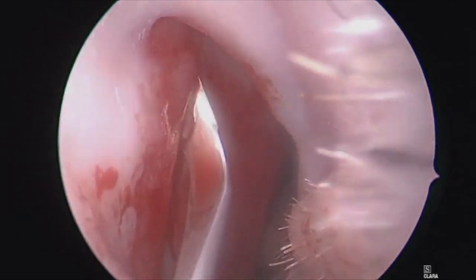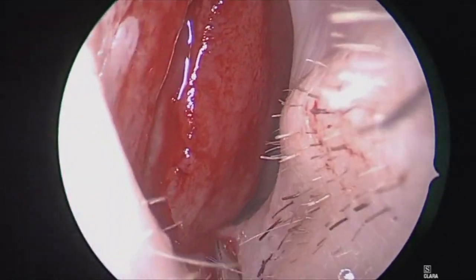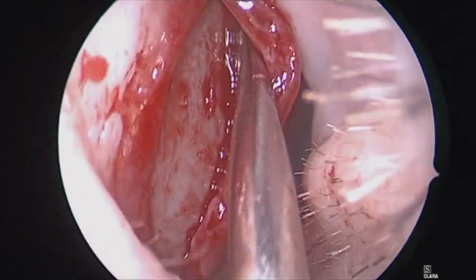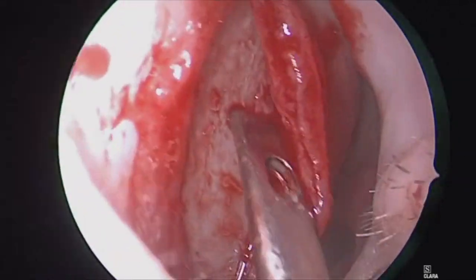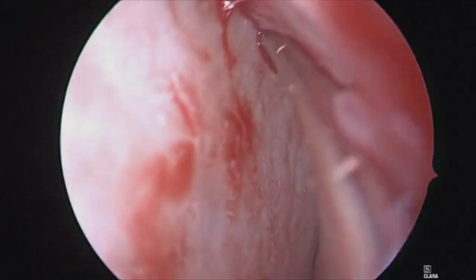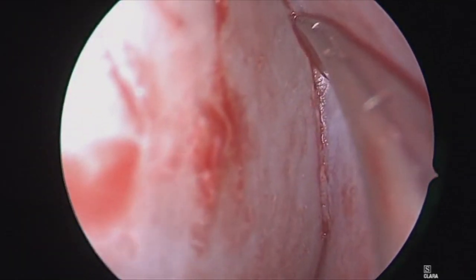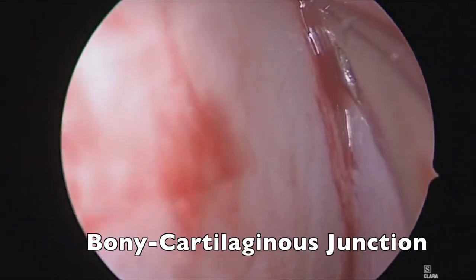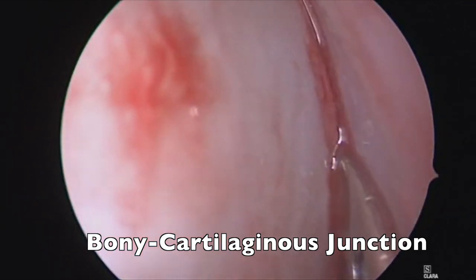We're just completing that incision a little bit higher there with our knife again, and it's nice to raise this in a very broad front, including very dorsally and towards the floor of the nose, to have nice wide exposure to decide where you want to take your cartilaginous cuts. Here we are raising this a bit more posteriorly, still in the cartilage just in front of the bony cartilaginous junction, and then getting onto the bone of the bony septum just past that junction and raising that more inferiorly as well.